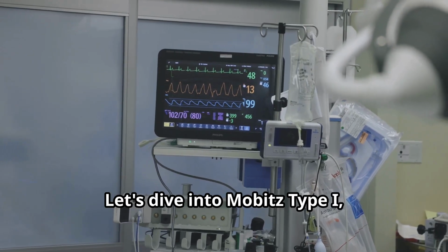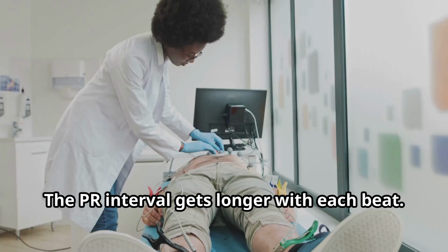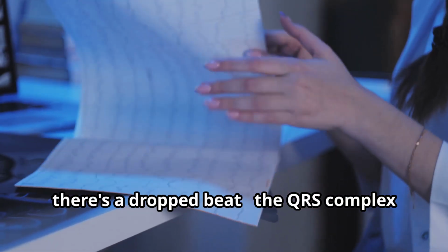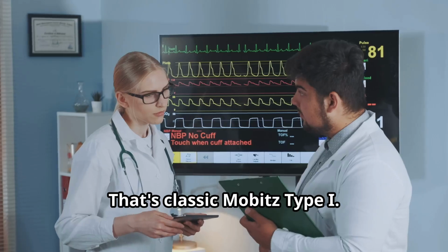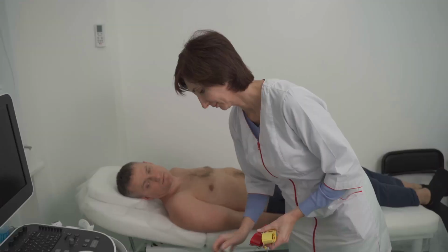Let's dive into Mobitz type 1, or Wenkebach. It's about a progressively lengthening PR interval. The PR interval gets longer with each beat. Then, there's a dropped beat. The QRS complex is missing. That's classic Mobitz type 1. It occurs due to a conduction delay in the AV node.